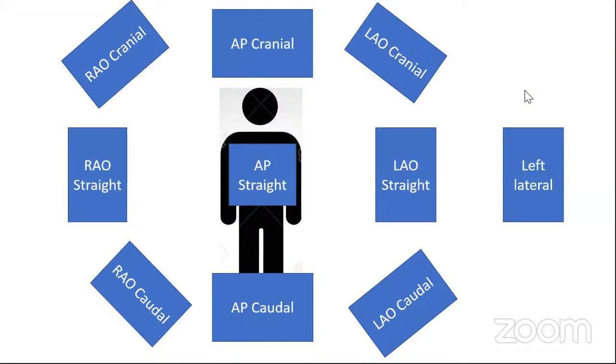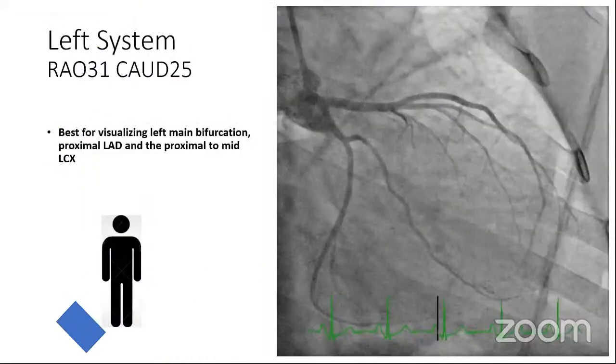So this is an example of a 50-year-old female presented with unstable angina. I've managed to get her full angiogram. So we'll just show some of these views. Identifying the views can, at the beginning, be difficult, especially if you don't have the actual view written.